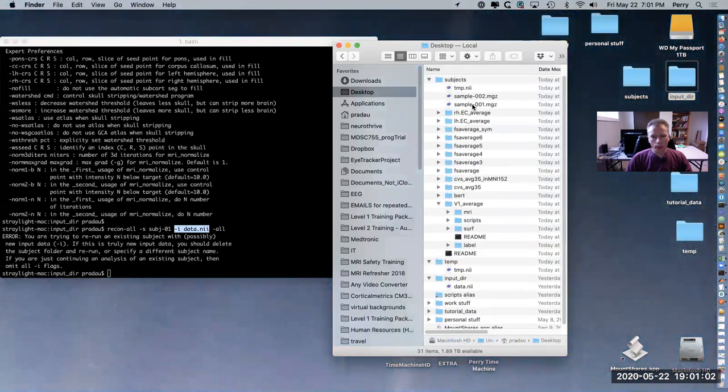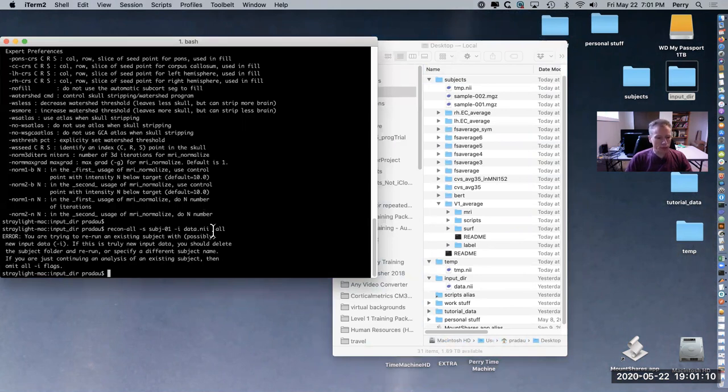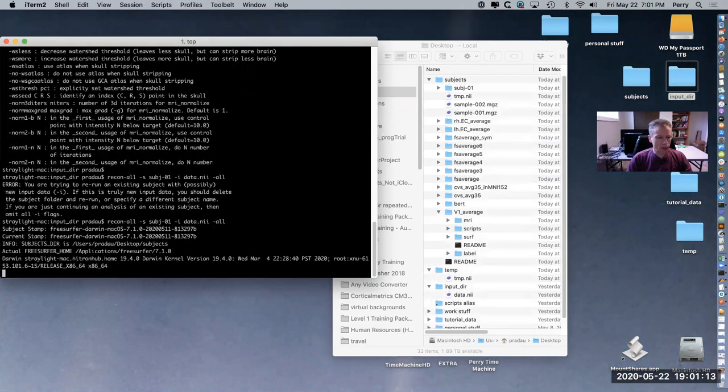But if you do want to run that and just continue on, then you would just drop the dash i flag. So let's run that - now it works properly.